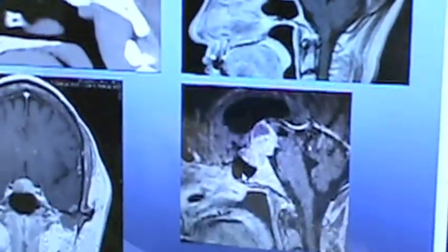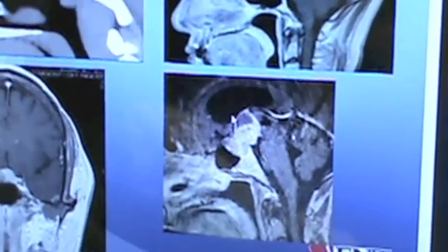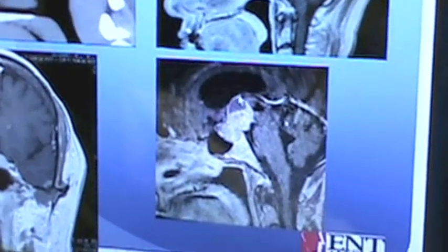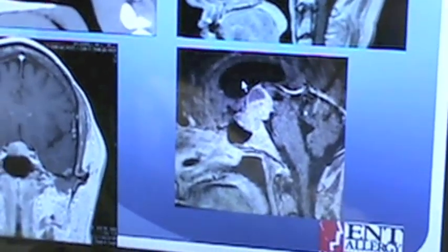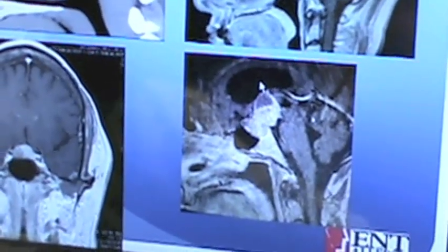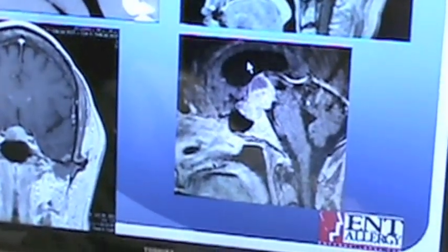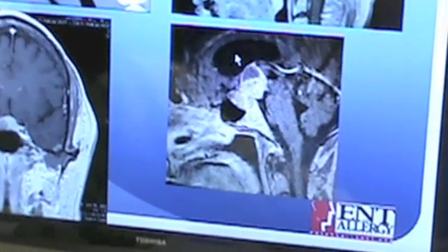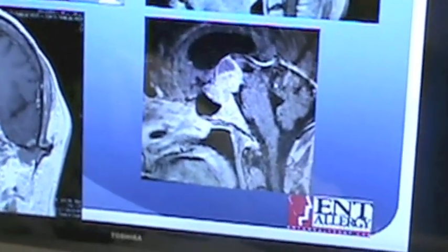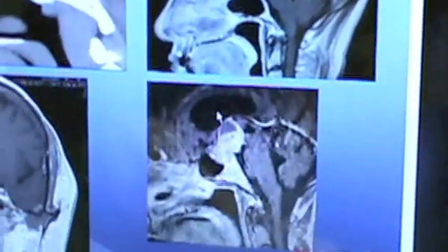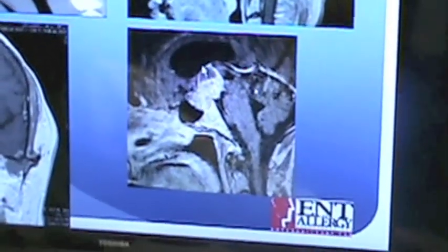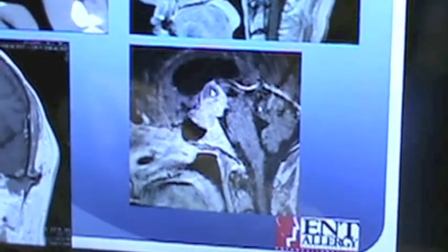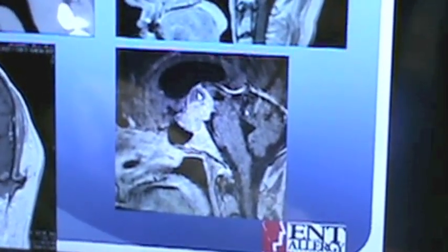And on this patient, a much larger growth that is actually blocking the CSF from flowing, so the ventricle is much larger as compared to here. That's normal. This gets very large, and this causes a change in mentation.